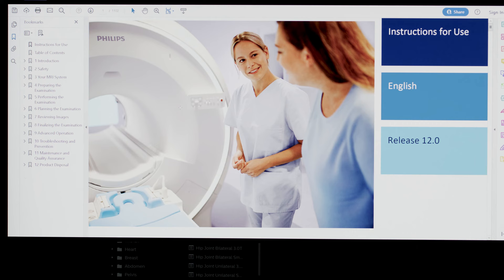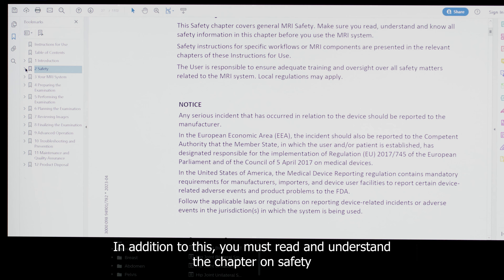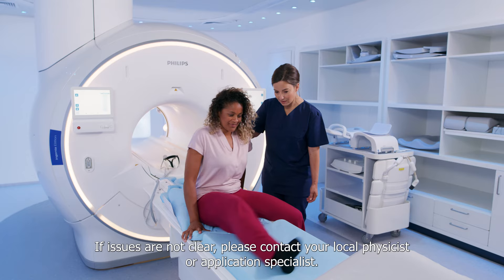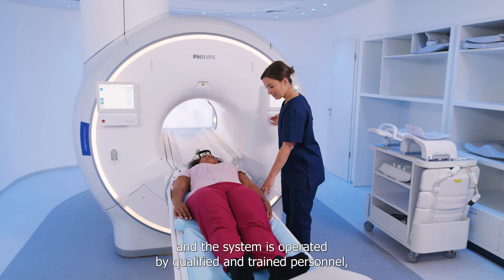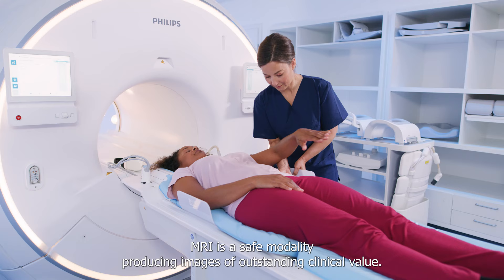These videos highlight some of the essential guidelines for the safe operation of an MRI system. In addition to this, you must read and understand the chapter on safety in the instructions for use of the MRI system. If issues are not clear, please contact your local physicist or application specialist. Provided that the appropriate safety precautions, as presented in the instructions for use, are observed, and the system is operated by qualified and trained personnel, MRI is a safe modality, producing images of outstanding clinical value.